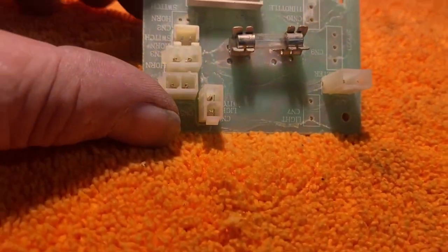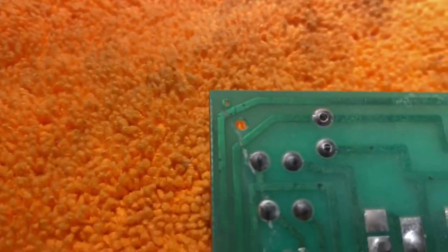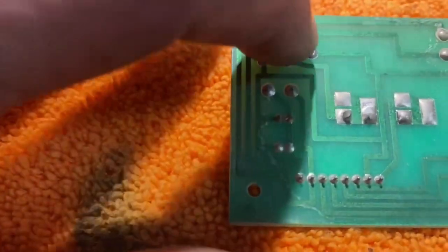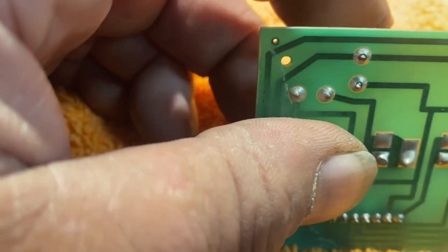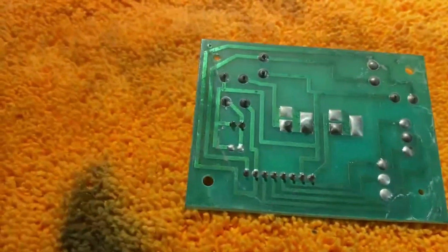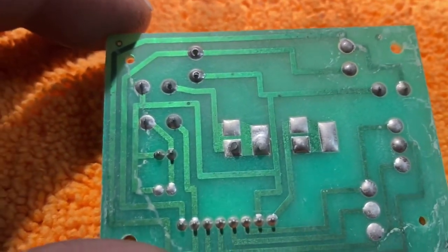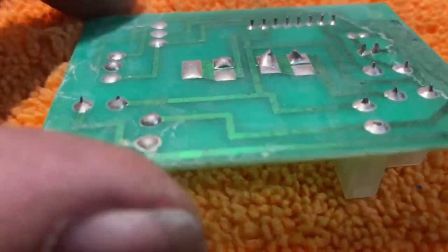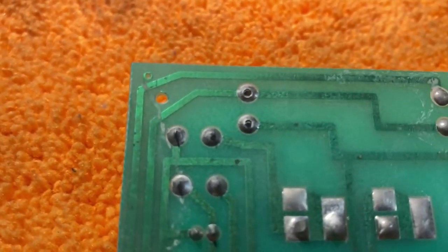I've removed the little circuit board from the top console and I'm looking it over. Just there is where the status light is attached, and you can see the solder has dried up and broken away. I'm not sure if that's going to fix it, but it's not going to be helpful it being unsoldered.